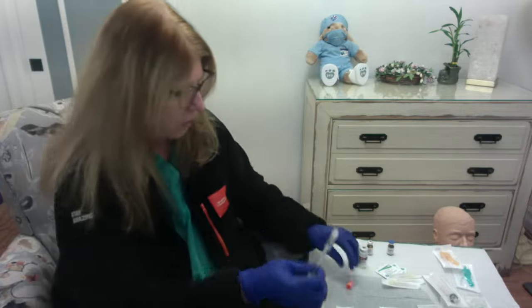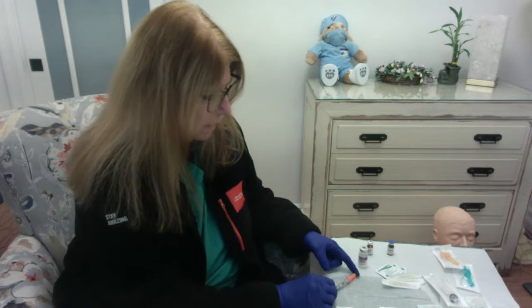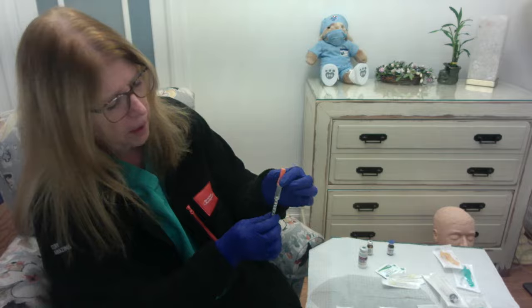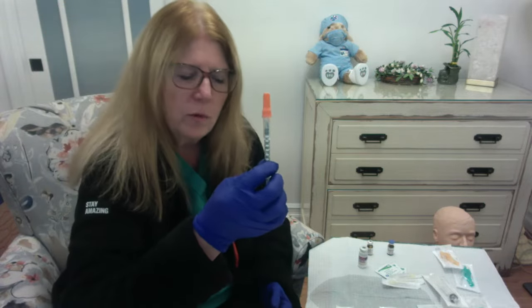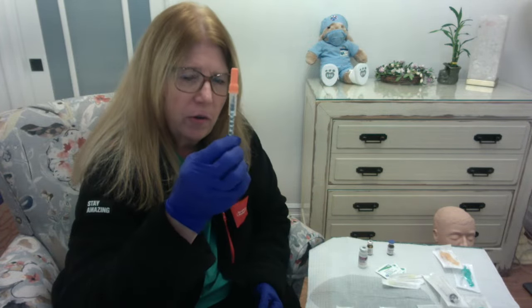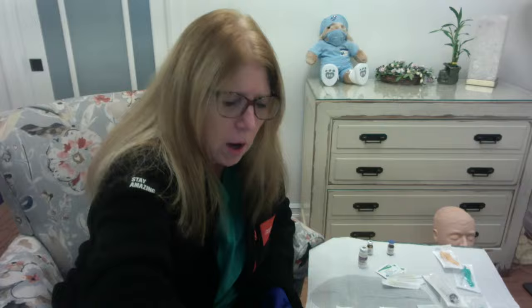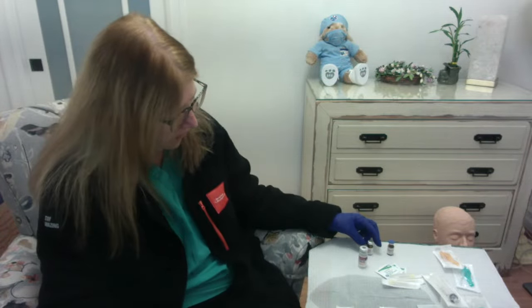I'm going to go for my cap again, one-handed, okay? Might need a little help with the finger, it's a big cap. And I'm going to push this down, okay? We're going to save this one because we're going to use this syringe when we practice subcutaneous injections in a little bit of time. Okay, so that's drawing up medication out of a vial.